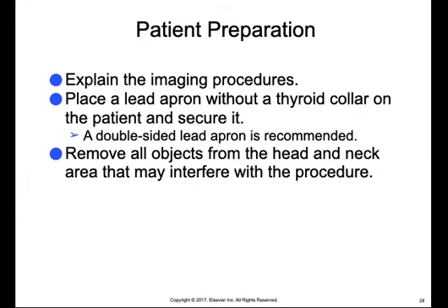This will include eyeglasses, earrings, intraoral and extraoral piercings, necklaces, napkin chains, hearing aids, hairpins, barrettes, or any other oral prosthesis or anything that will get in the way of the X-ray, anything metal.